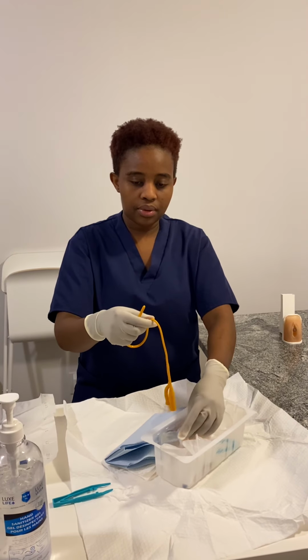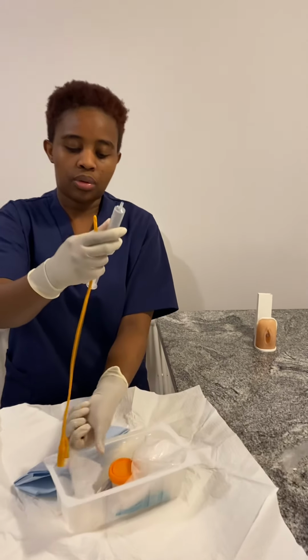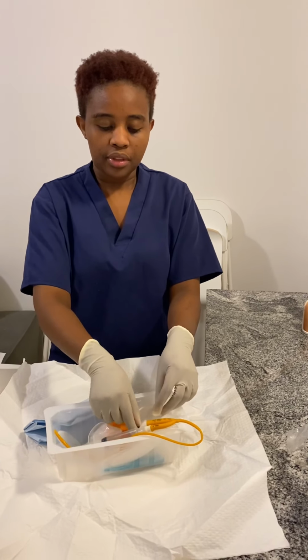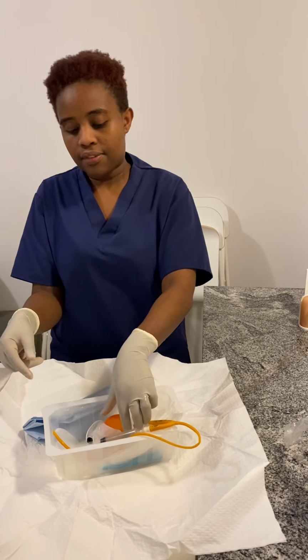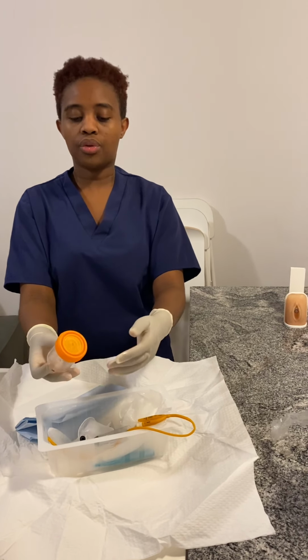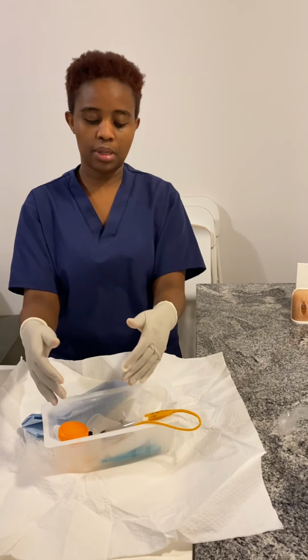So now I've lubricated the catheter. I'm going to attach it to the syringe. The syringe is going to help me inflate the balloon. In an event where my physician has told me to collect a urine specimen, I'm going to use this cap. But in this situation, I'm not going to use it, so I might still keep it in the tray.